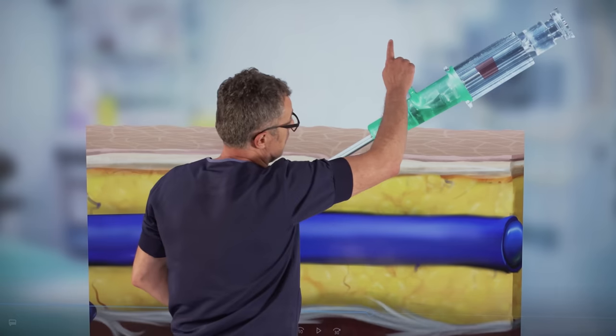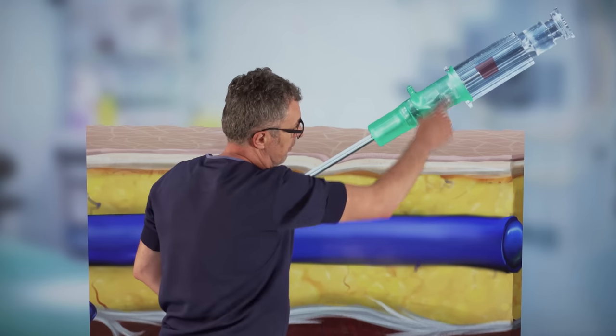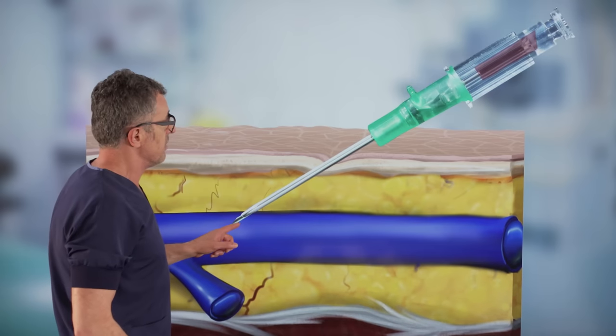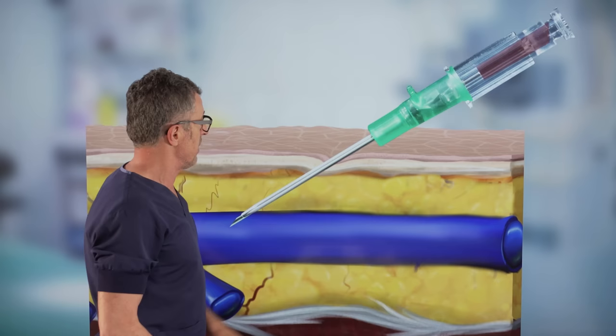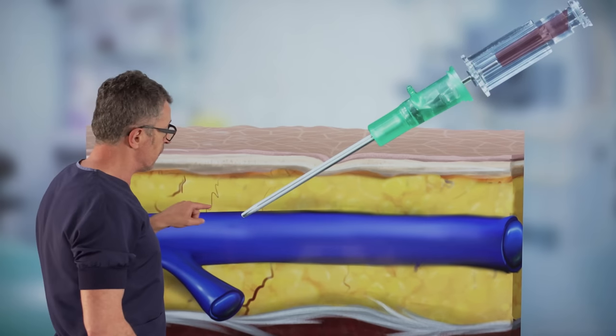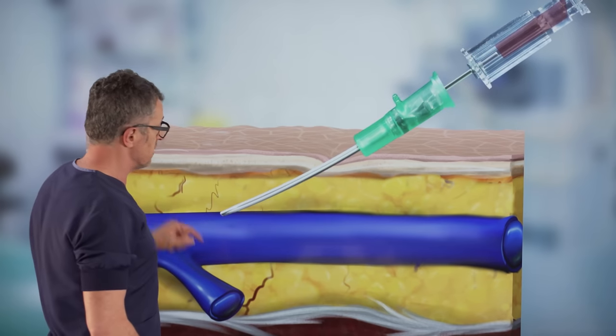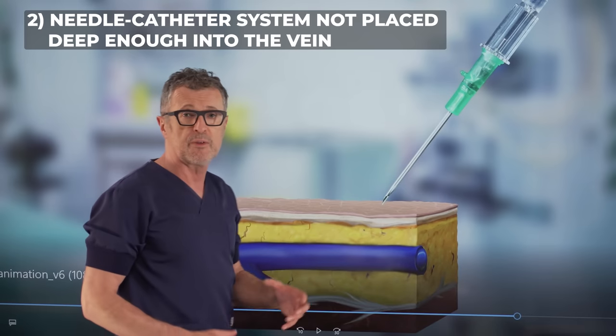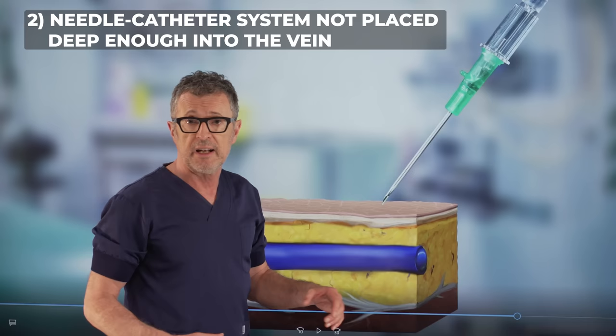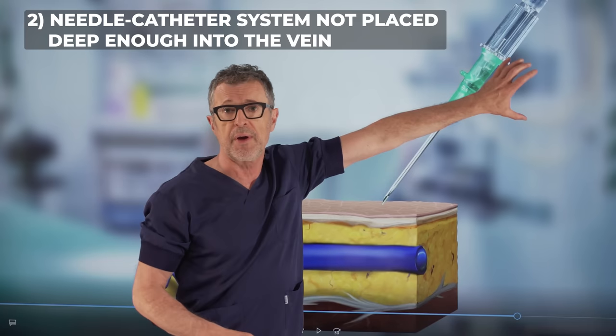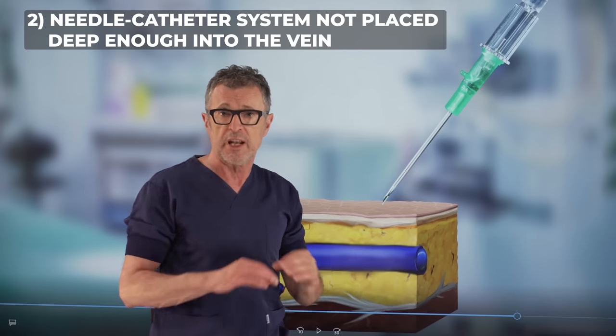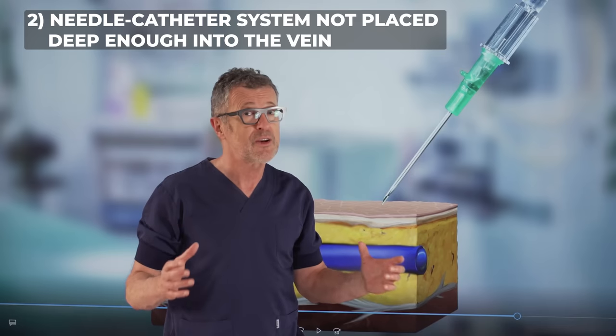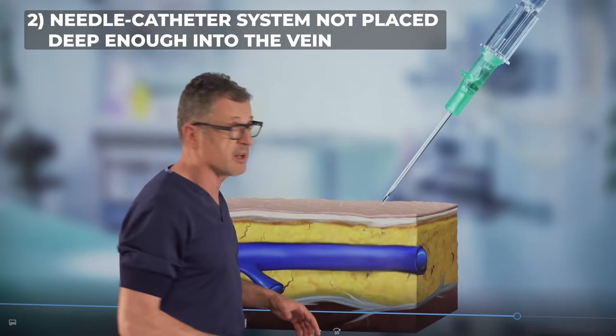So in this case, we should decrease the angle of the needle and advance the catheter needle system further. But in this example, this doesn't happen. The operator is happy with the fact that this is already inside the vessel and attempt to feed the catheter will result in a catheter placement inside the subcutaneous tissue but not intravenously. So that is one of the most common mistakes that you see all the time. And that is as soon as the flashback appears, the operator is happy with the position and tries to feed the catheter over the needle. Whereas in fact, you should advance a deeper inside the vein to make sure that there is enough slack and that the catheter is inside the vein as well.